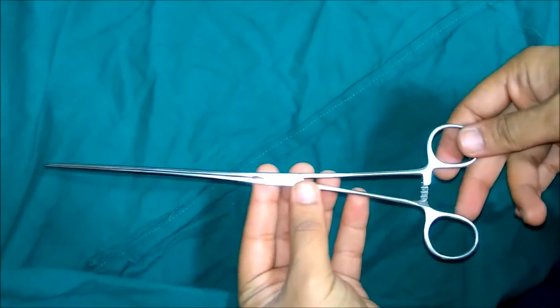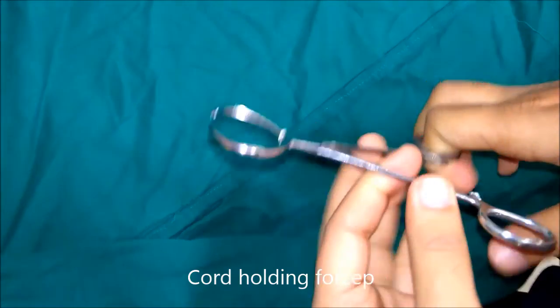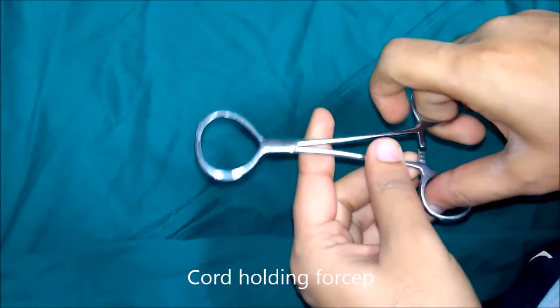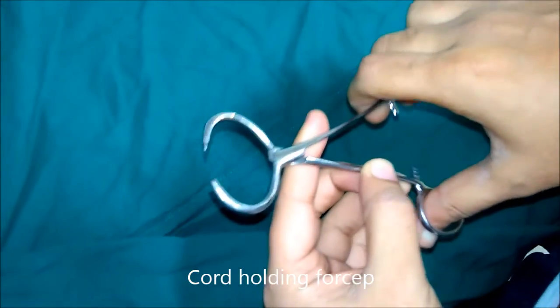This is cord holding forceps. It is used during hernia operations to hold the spermatic cord so that the cord can be retracted during the repair of the posterior wall of the inguinal canal.